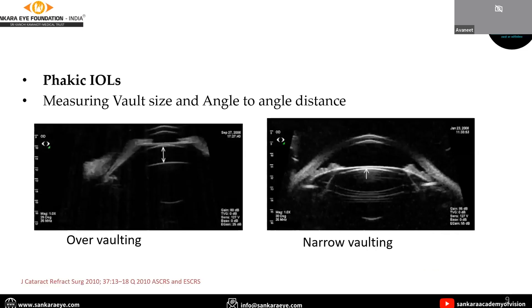In phakic IOLs, the anterior segment OCT can be used to measure the vault size. Here we can see the distance between the posterior part of the phakic IOL and the anterior natural lens — it has increased, so over-vaulting is present in this case. In another case, there is a very narrow vault.